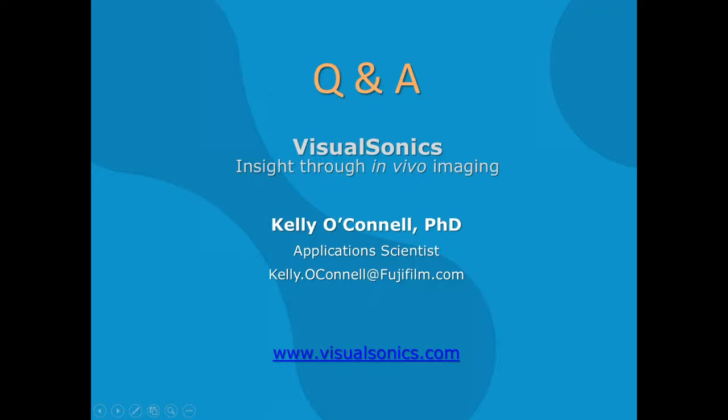A question here, I'll take one actually, and then another one for you, Kelly. There was one question here about the quality of the images required to use the speckle tracking. Kelly, feel free to jump in. I often say this is an old software developer's joke, but the truth of it is garbage in, garbage out. If you have images that are overgained, that have a lot of ring down artifacts or noise in them, or positioning of the heart is not great in the image, then the speckle tracking is not going to be that great.